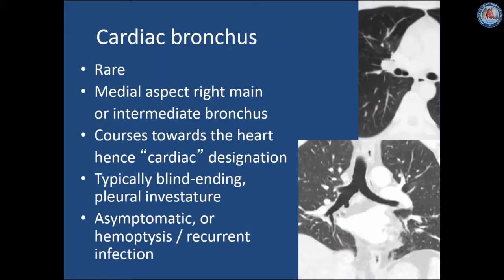A cardiac bronchus is a rare anomaly that arises from the medial aspect of the right main bronchus or the medial aspect of the bronchus intermedius. It generally courses towards the heart, hence the cardiac designation. These are typically blind-ending small bronchi, but occasionally will supply a small amount of lung with a pleural investiture. Most patients are asymptomatic, but occasionally patients will present with hemoptysis or recurrent infection. One can see on the axial image the medially located cardiac bronchus medial to the bronchus intermedius, and on the coronal image the same bronchus extending medially towards the heart.